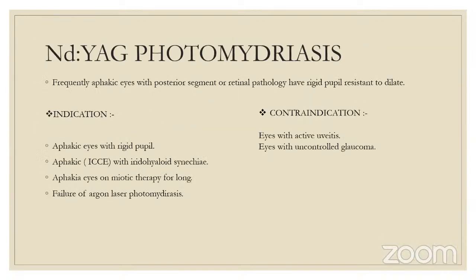I have no experience with this with plastics. There are other indications in glaucoma. One thing is we do laser suture lysis, especially in advanced glaucoma, where we want strict titration and don't want to wait 3 weeks or 6 weeks. We suture the flap, then we release one suture with laser suture lysis.